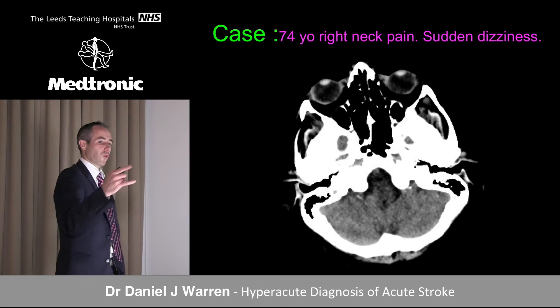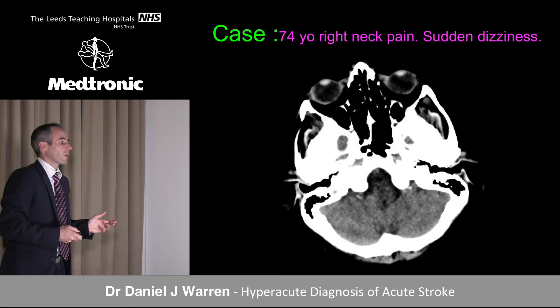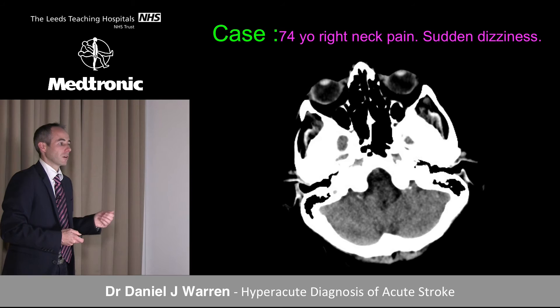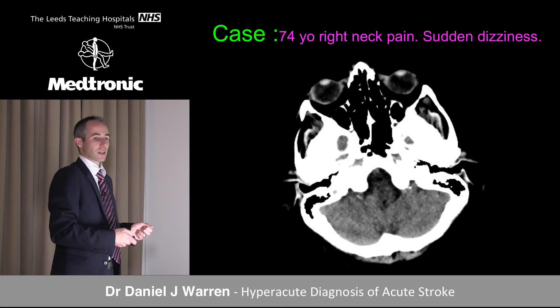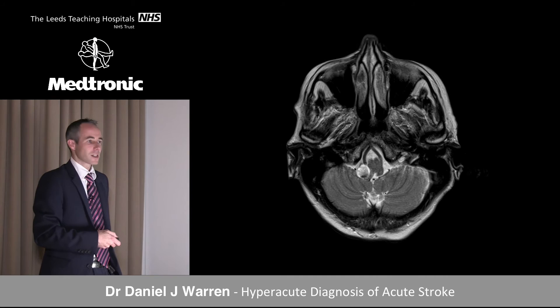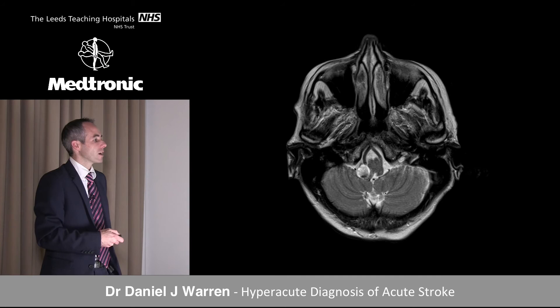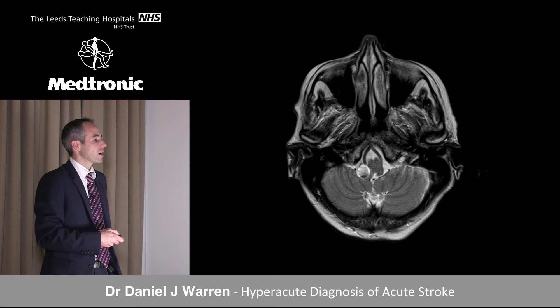Looking for subtle signs — a CSF space coming from the foramen of Luschka is seen on the left but not the right. This could easily be walked past as it looks the same signal intensity as brain parenchyma. On MR it stands out more — it's rounded, associated with a vertebral artery, with a vessel nearby. CT angiography confirms this is a PICA aneurysm.